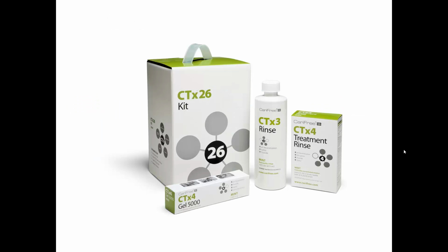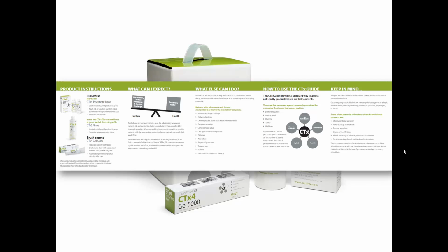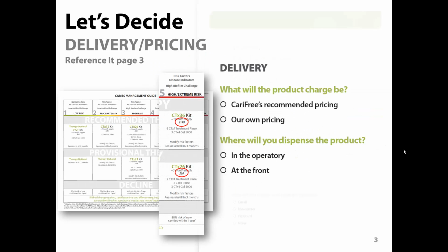As far as instructions go, each kit contains an insert with the proper instructions for product use. If you compare, you will notice there are conflicting instructions on the products themselves versus the instructions on the insert, and that's because the products are labeled for individual sale. The instructions on the insert are the most effective and the ones we want patients to follow, not the instructions on the product.